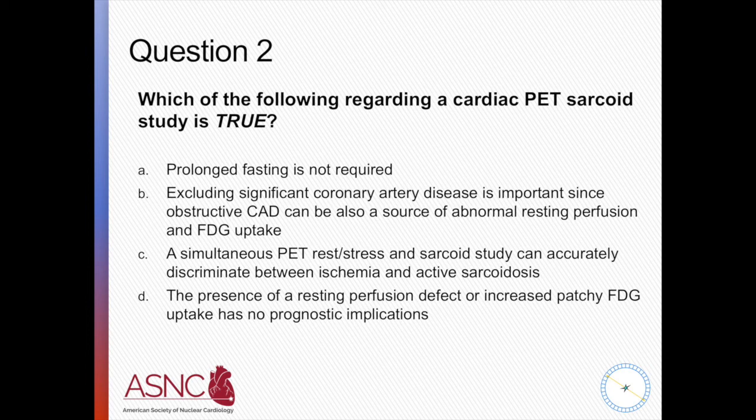But this is an important point, because when you're trying to look for sarcoid in the myocardium, you really need to suppress the normal uptake. Otherwise, if you get diffuse myocardial uptake, you can't tell whether it's a negative study or whether somewhere in there are areas of inflammation. So preparation is very, very important. To us, the ideal study just has persistent blood pool. Everything is in the cavity of the ventricle, and there's nothing in the wall. Then you're pretty sure that it's a negative study.